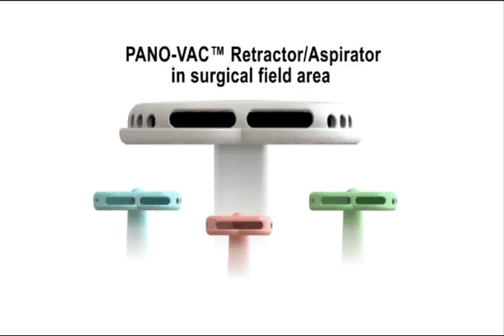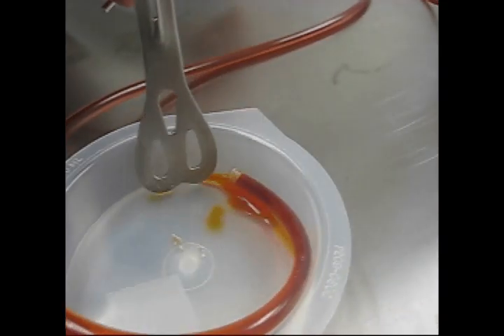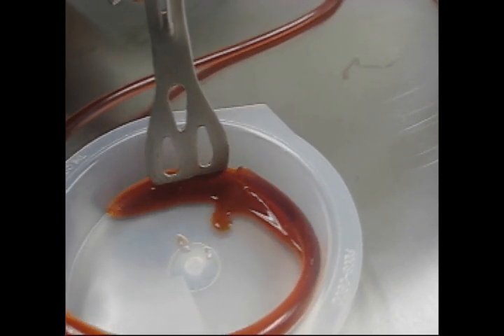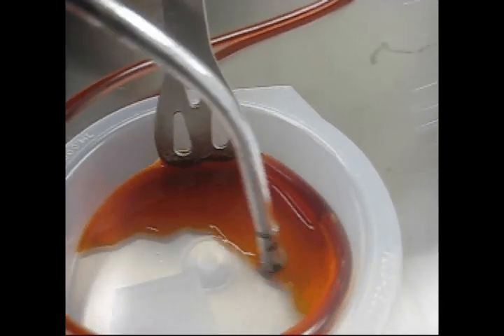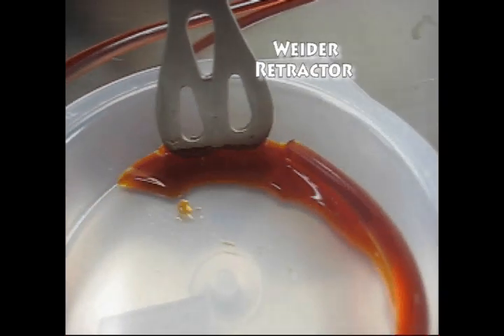PonoVac Retractor/Aspirator. In this video demonstration, we are showing the traditional way of retracting tissue and suctioning of the surgical field, which requires two separate surgical instruments: a retractor tool and a suctioning device.